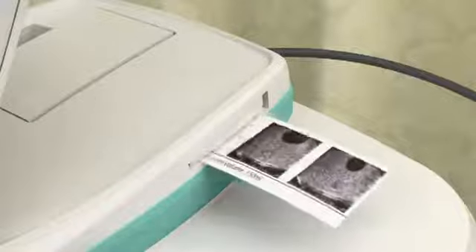When you have verified an accurate scan, the screen will display your results. Wipe the gel from the probe and the patient. At this point, you may record a voice annotation to save your exam, print the exam result from the onboard printer, listen to previously recorded annotations, or review data from saved exams. You can also return to the home screen and perform another scan, or turn off the instrument.